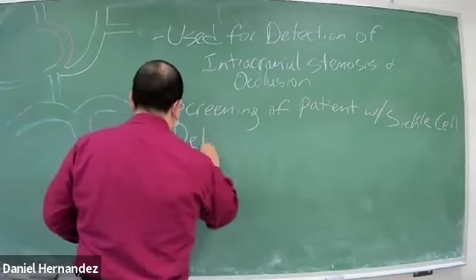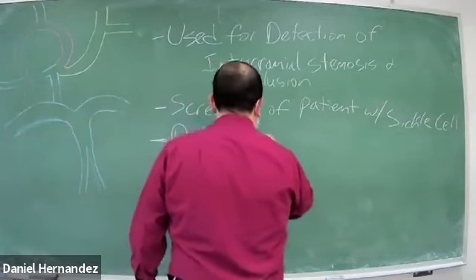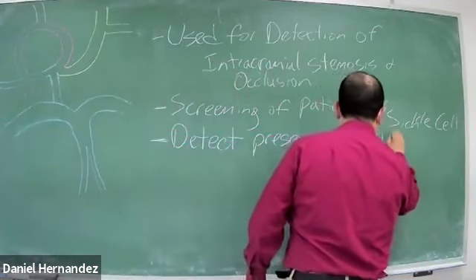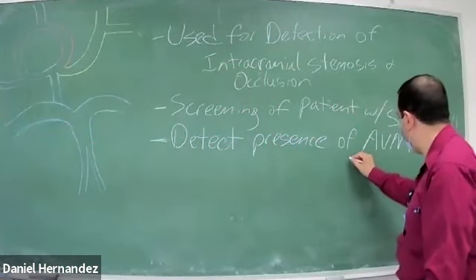You can use it to potentially detect the presence of AVM. AVM stands for arteriovenous malformation.